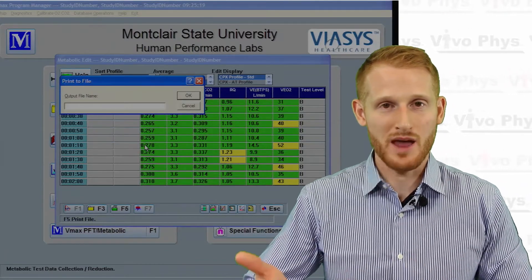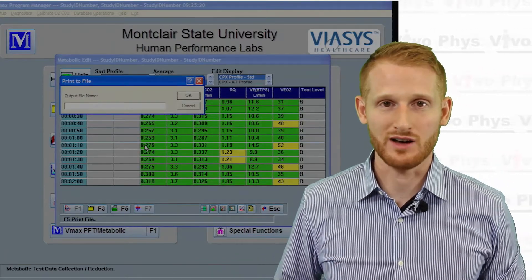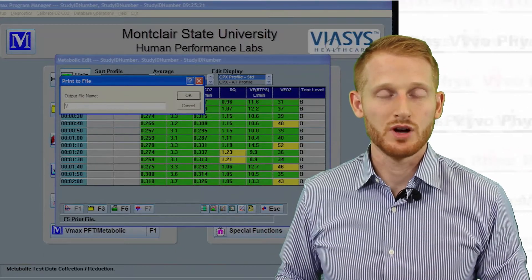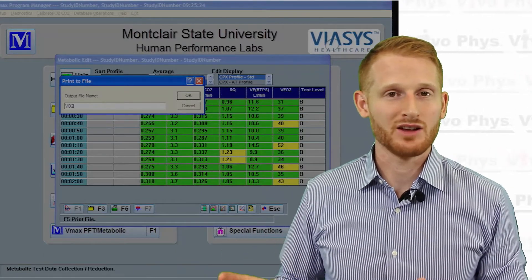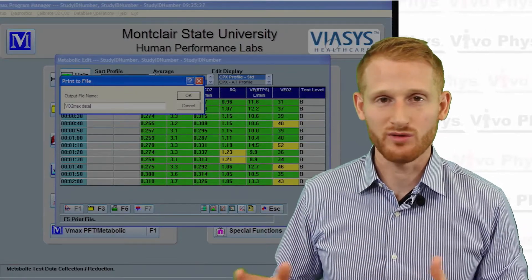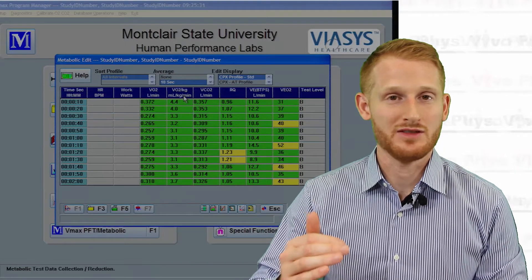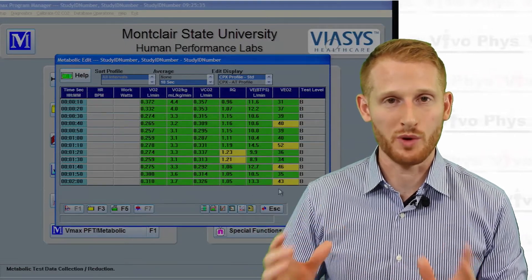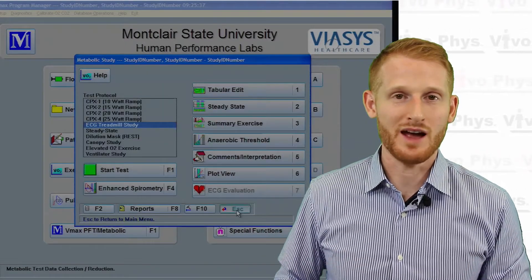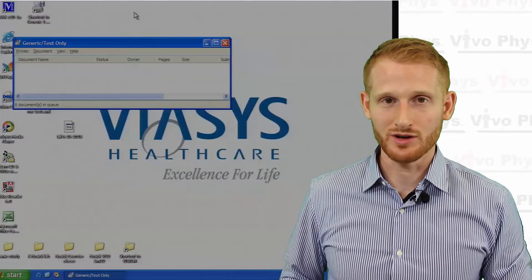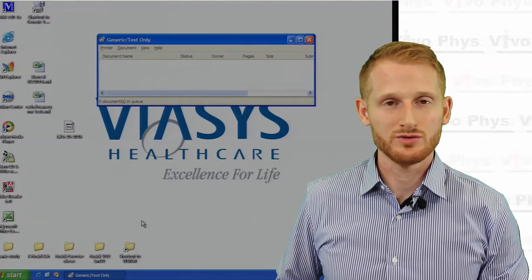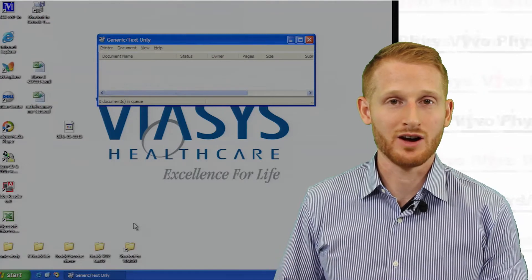It's going to essentially print those results as a text file, so it's not going to actually print a paper document but it's going to create a text file for you. Once you hit that print button, it's going to bring up a dialog box to give it a file name. Give whatever file name you want, click OK, and then just go ahead and hit the prompts to exit all the different windows of the software and get it back to the desktop of the computer.